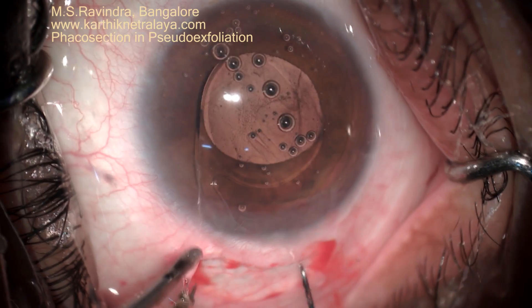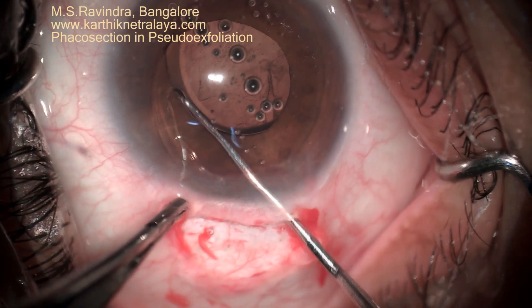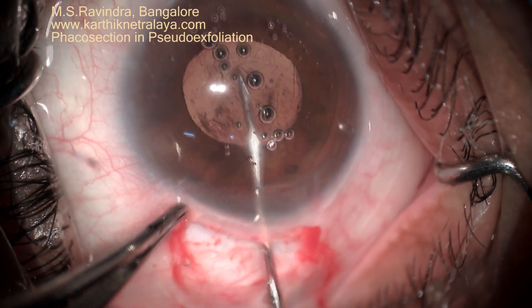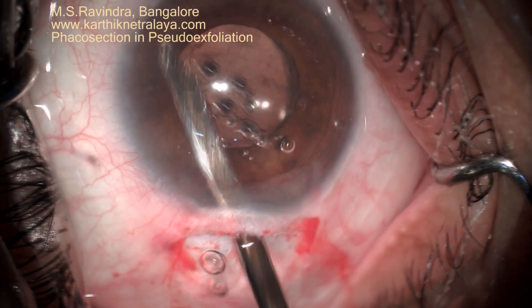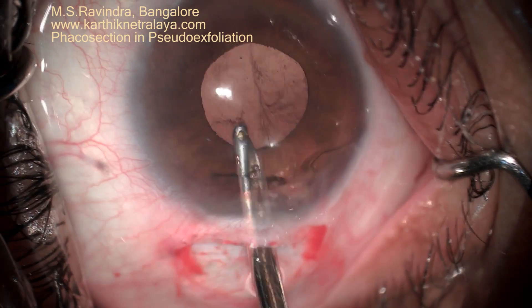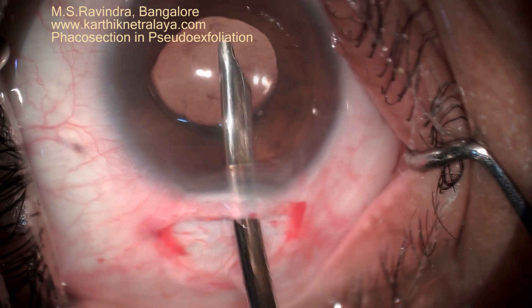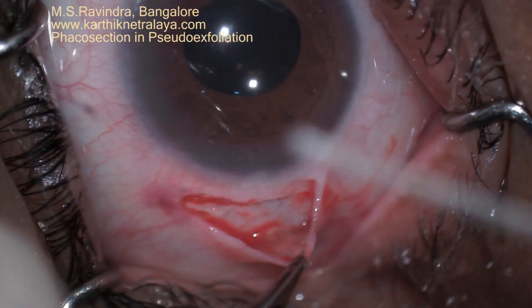All lenses are compatible with this technique as there is no zonular disruption. Aspirate the entire viscoelastic from behind and in front of the lens, in the capsular bag and the amount stuck on the back of the endothelium. The wound can be closed with fibrin glue.